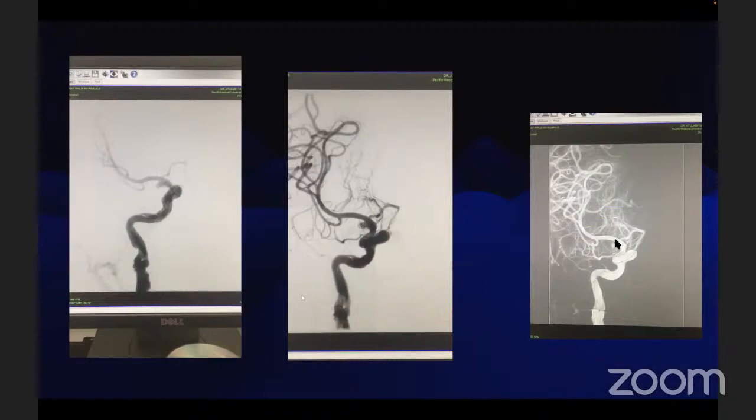His GCS was poor. Though we were planning supraclinoid, there is still dysplastic ICA beyond the aneurysm, so we wanted to place a flow diverter to prevent further progression, at least in the intracranial part. To reconstruct the proximal part also, we were thinking how to approach proximal reconstruction of the ICA, if at all we wanted to do that. Covered stent, sir? Covered stents, multiple covered stents we may have to keep.